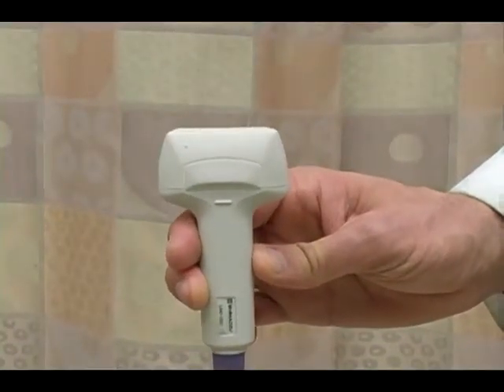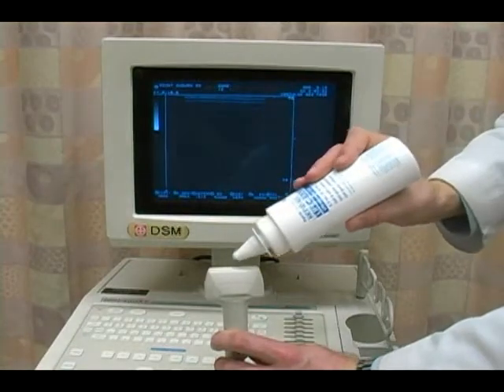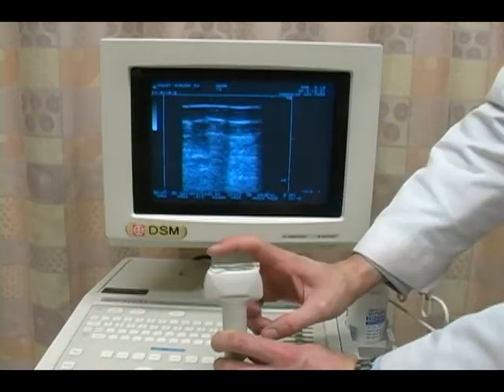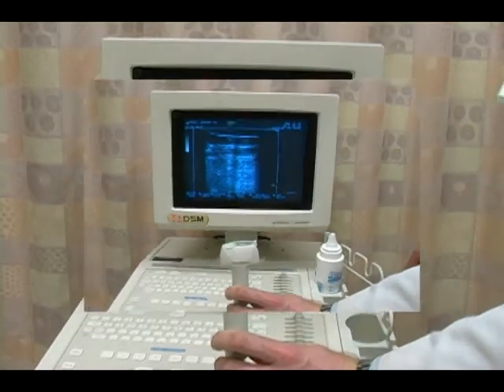Ultrasound probes usually have a probe marker on their casing that will aid orientation of the probe in relation to the ultrasound monitor and in scanning the patient. To confirm the proper orientation, hold the probe in front of the ultrasound monitor and apply ultrasound gel to the left side of the probe, or touch the left probe surface with a fingertip.